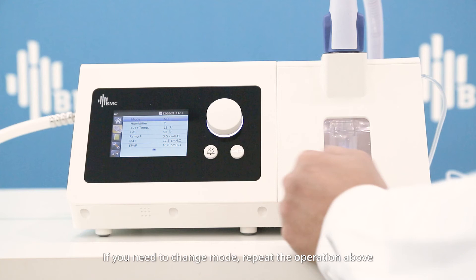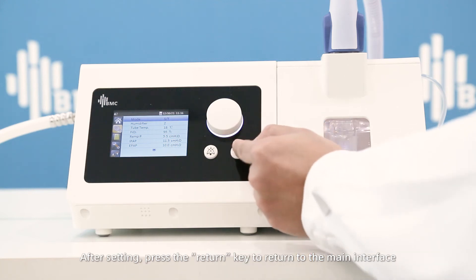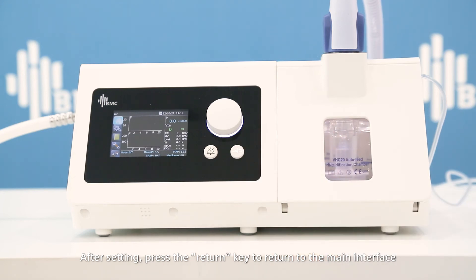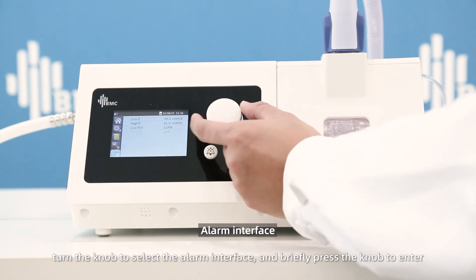If you need to change mode, repeat the operation above. After setting, press the return key to return to the main interface. Turn the knob to select the alarm interface.